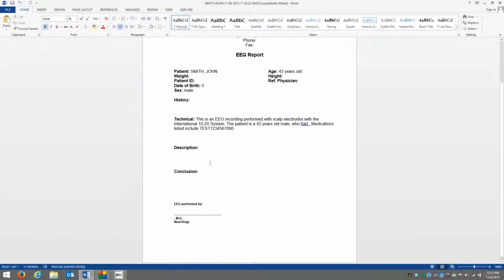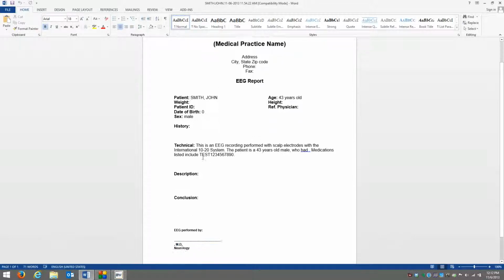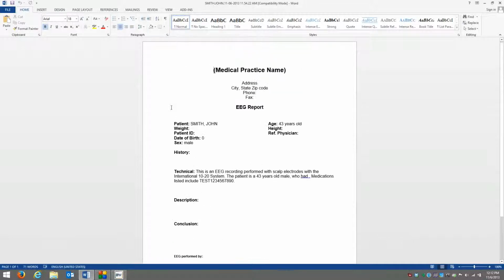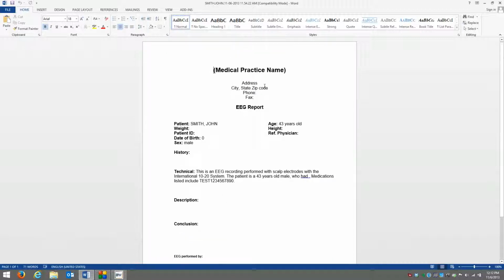This is 100% customizable. We have fields that auto-populate depending on what information we've put in for this exam. As you can see here, we can customize all of these directly from our end or your end as well if needed.